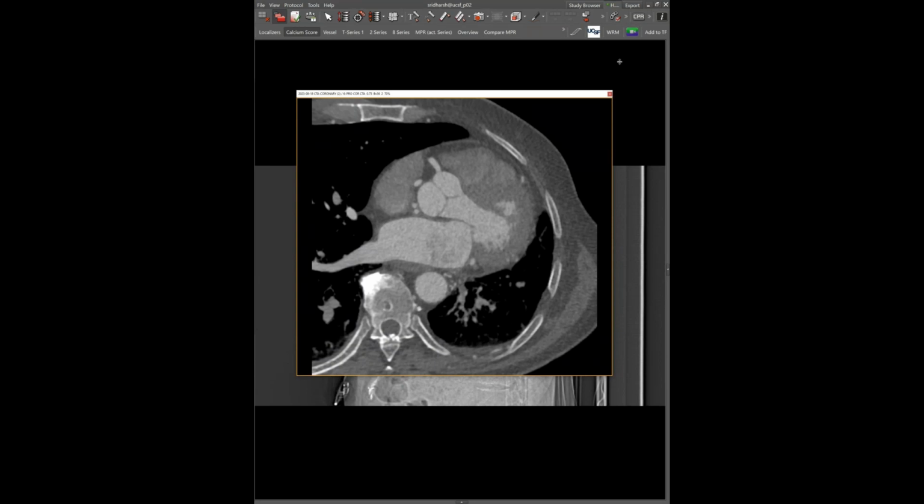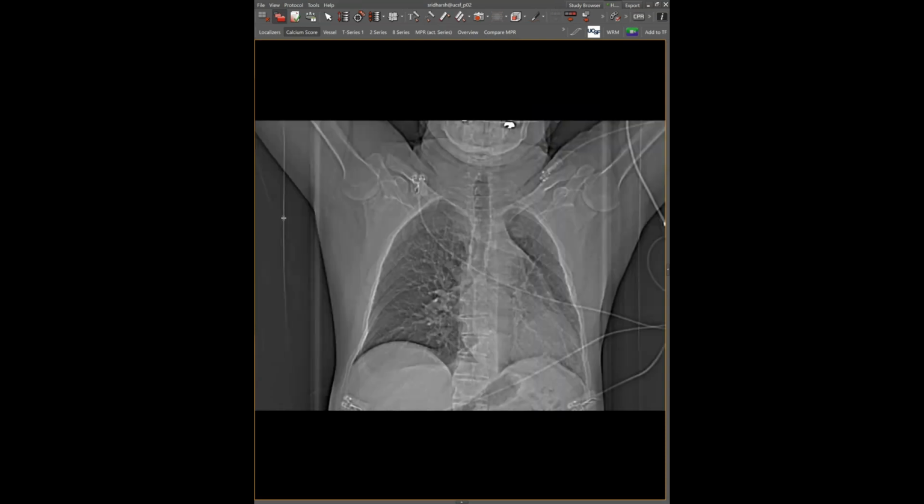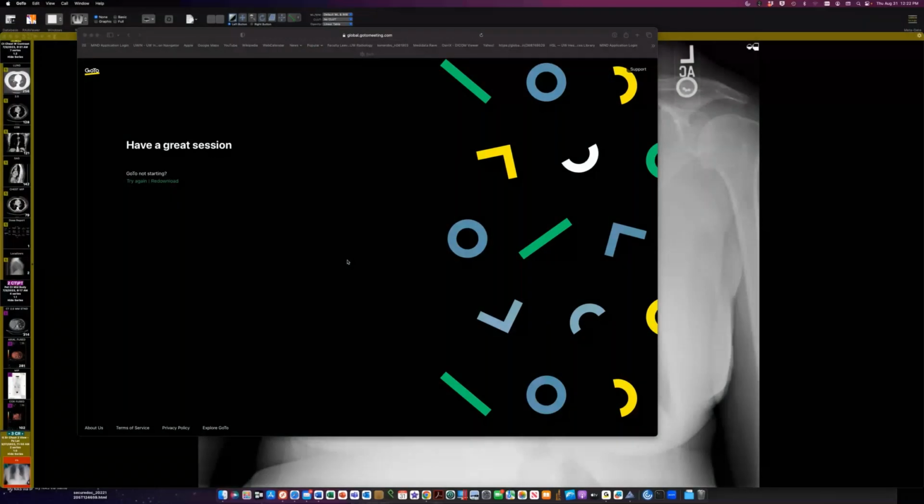Right. Let's see, David, you're on. Do you have any cases this week? All right. Oops. Let's see. View control here. Can people see a radiograph, one hopes?